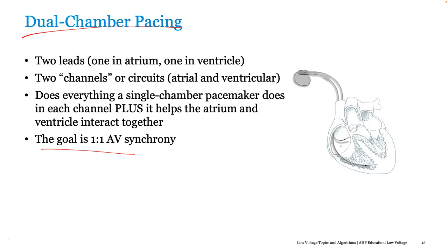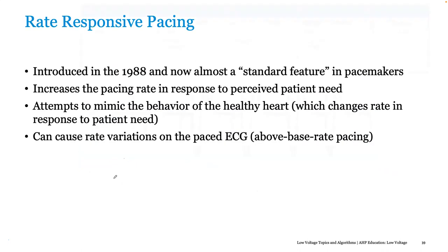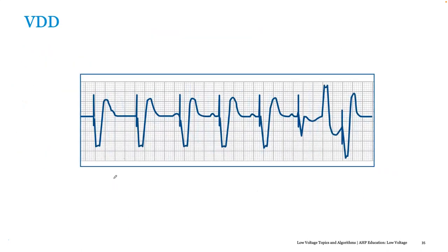So I don't think an atrial lead is worthwhile in these patients. Personally, I would put in an RV and an LV lead and cap the atrial port with a little pin port plug. The second thing depends on the level of device that you have. A lot of the more modern devices these days have something called V-sense response, meaning that at the base rate of 60 or 70, if they're below that, then great, you'll be biventricular paced. But with AF, if you get more fast conducted events, then by turning on ventricular sense response, it will trigger an LV pace on top of the QRS, on top of the V-sense. So it helps you up your bi-V pacing a little bit.